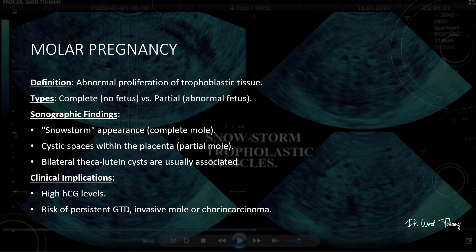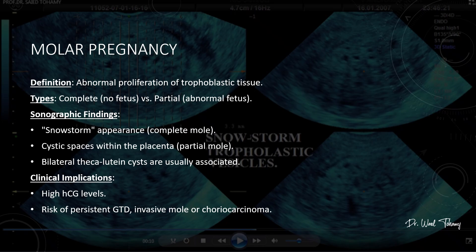Now let's move to molar pregnancy — an abnormal proliferation of trophoblastic tissue. There are two main types: complete moles, which have no fetus, and partial moles, which include an abnormal fetus. On ultrasound, a complete mole gives you that classic snowstorm appearance, while a partial mole may show cystic spaces within the placenta. Bilateral theca lutein cysts are often associated. Clinically, expect very high beta-HCG levels, and always remember the risk of persistent gestational trophoblastic disease, invasive mole, or even choriocarcinoma. Close follow-up is essential.